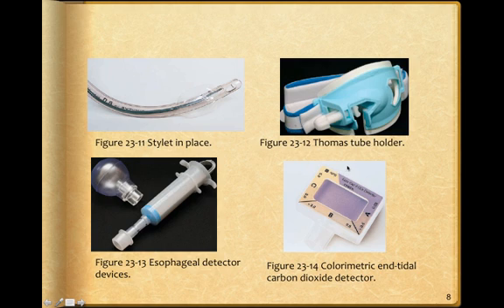Stylet in place, and on this one here we can actually see the Murphy's eye, which is right here. The stylet itself should not go anywhere below the Murphy's eye. It could cause trauma to the airway.